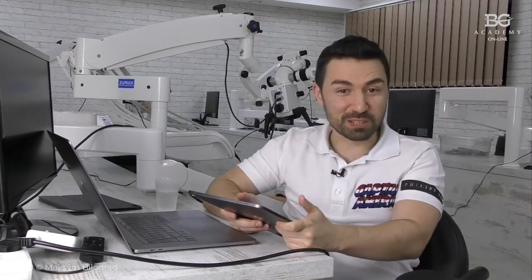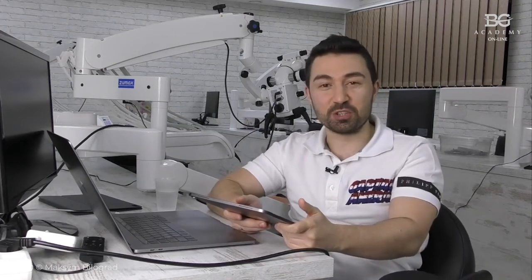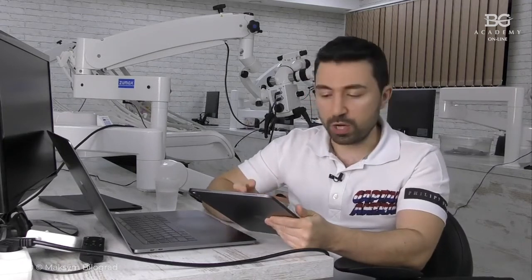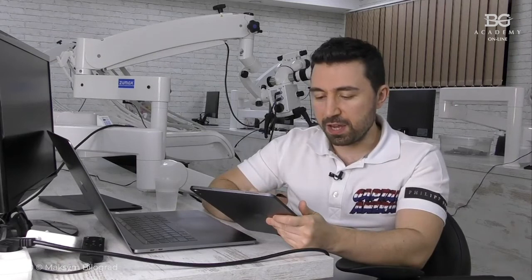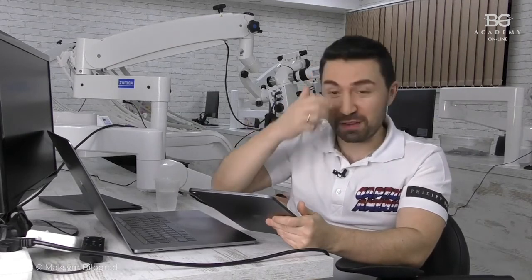We're still full of energy because we are discussing with you a really interesting topic, on-demand problems and protocols for veneer bonding. So let's go straight to your questions because we have a few interesting questions here, and I would love to answer in my best way.